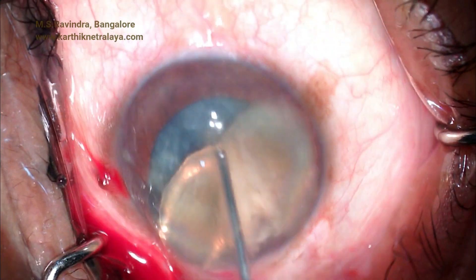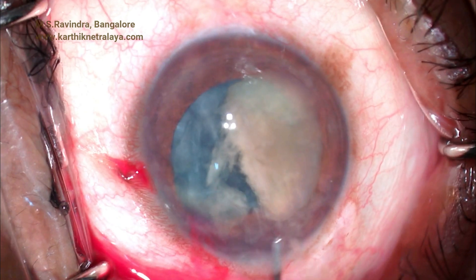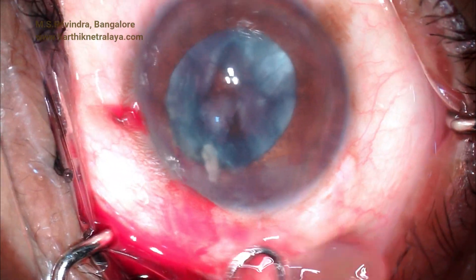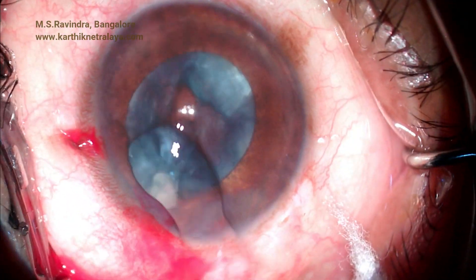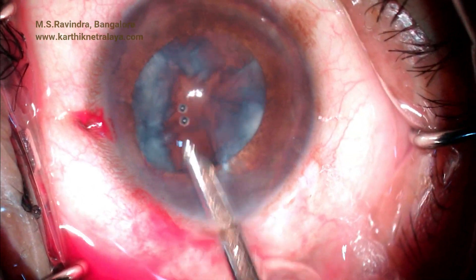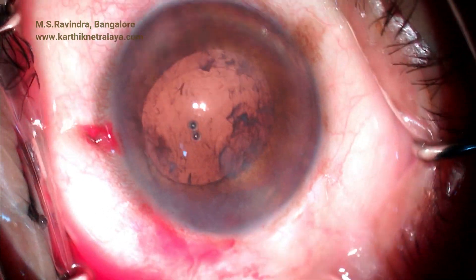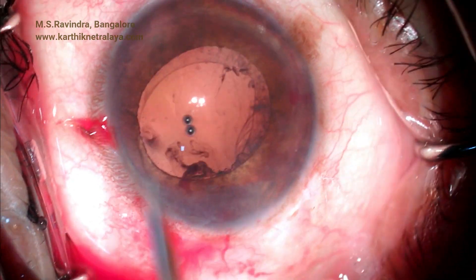The pressure inside the eye is atmospheric, so there is no posterior push on the capsular-zonular apparatus. There is no risk of zonular tear, dehiscence, or posterior capsular tear in this procedure. The cortex is aspirated using very low fluidics; the inflow and outflow are controlled by the surgeon under the guidance of the microscope. The cortex is aspirated completely, as residual clear cortex in the periphery can cause post-operative inflammation and glaucoma.